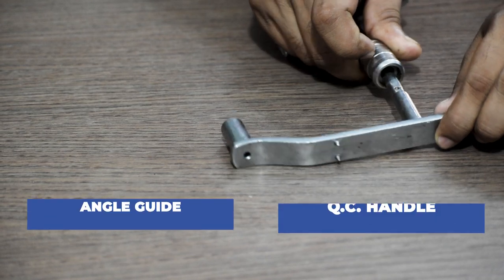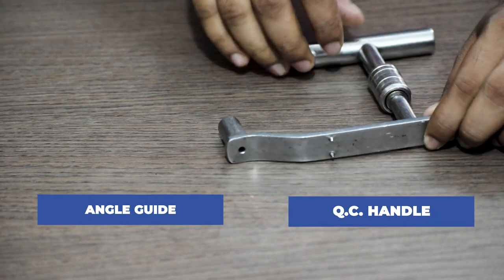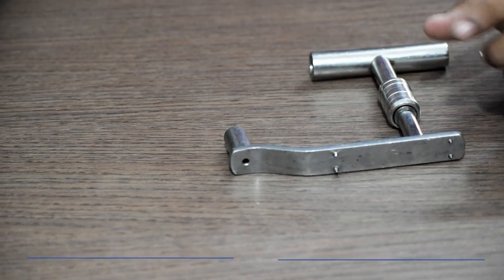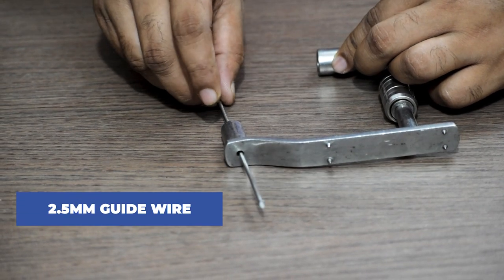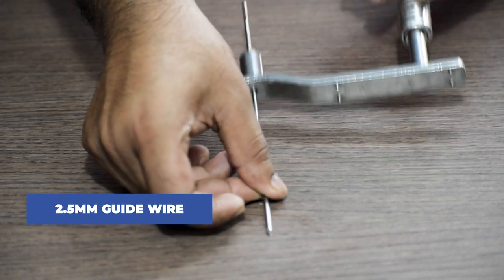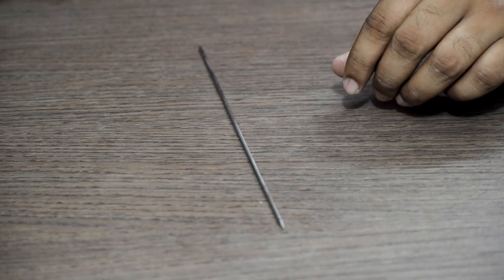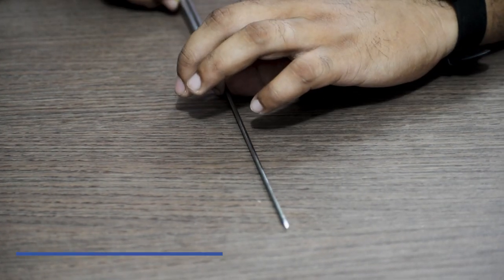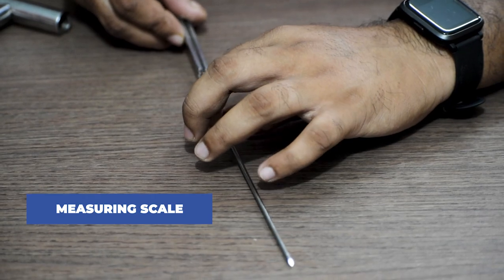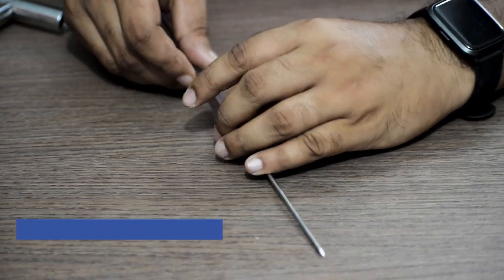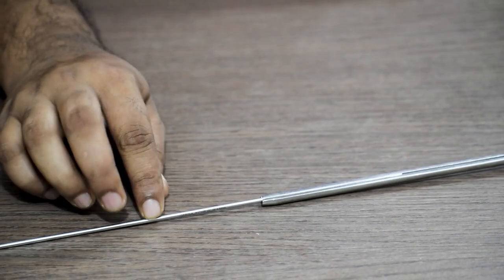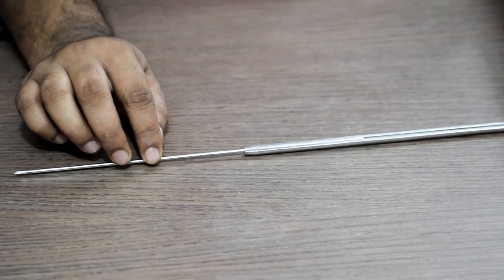First we will take the angle guide and fix the QC handle attachment to it. Once done, we will insert the 2.5 mm guide wire through this hole into the fracture site and then remove the angle guide. The guide wire stays back. Next we take the measurement of the guide wire using a measuring scale. We measure the length of the guide wire inserted in the femoral neck.